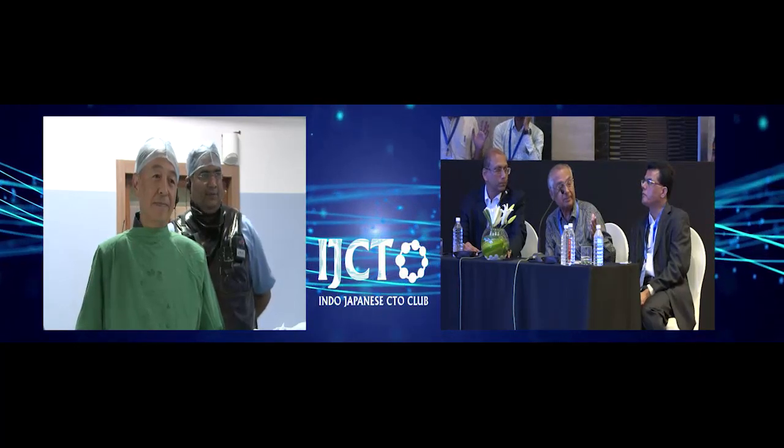As a matter of fact, the Philips equipment Clarity has actually 50% dose reduction, scattered dose reduction, as compared to the earlier version. So what we bought 2 years earlier, we immediately changed. The complete overhaul was done, and the company came forward and gave us the newer equipment with a 50% reduction. So anytime you find that there's an opportunity to reduce dose, I think do that.